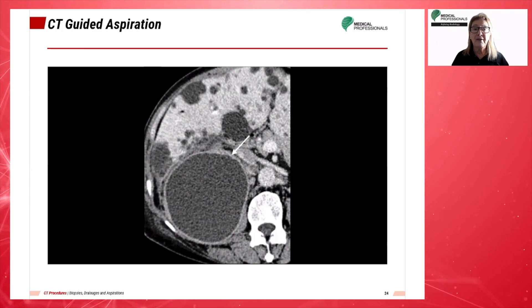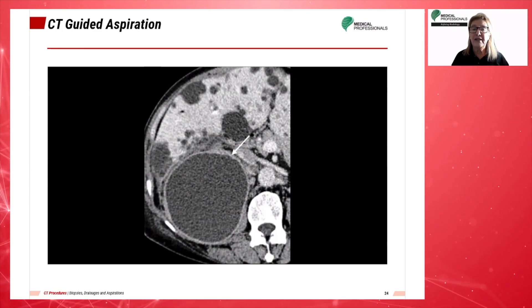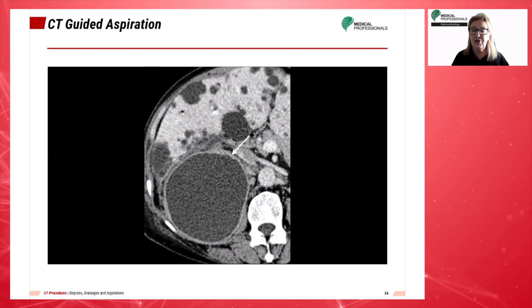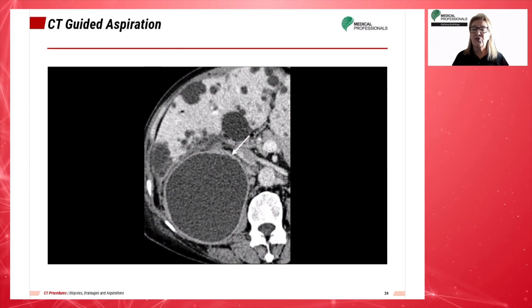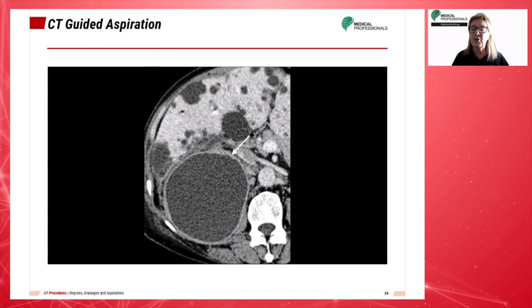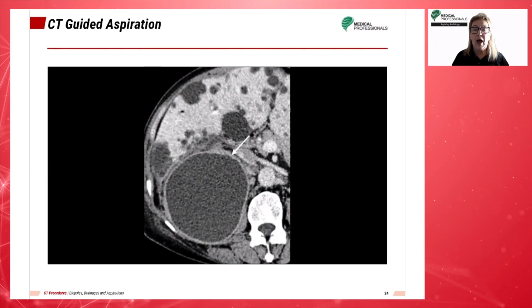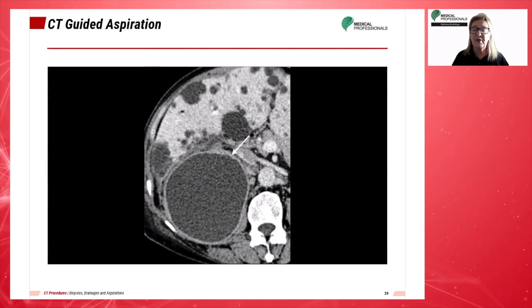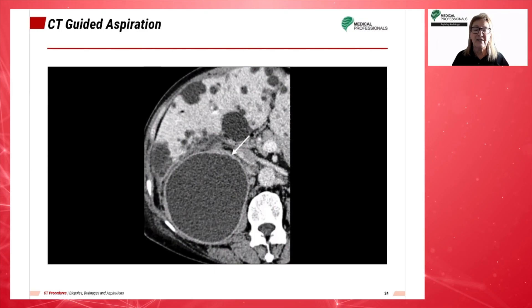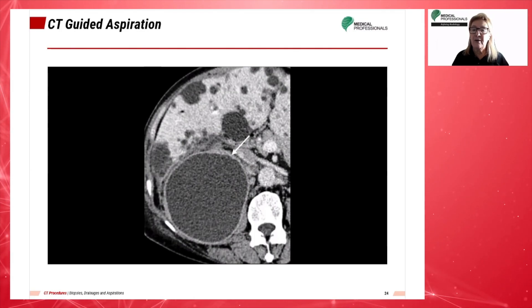On this portal venous phase image, the cyst shows discernible wall thickening with prominent wall enhancement and pericystic fat infiltration, as noted by the arrows.